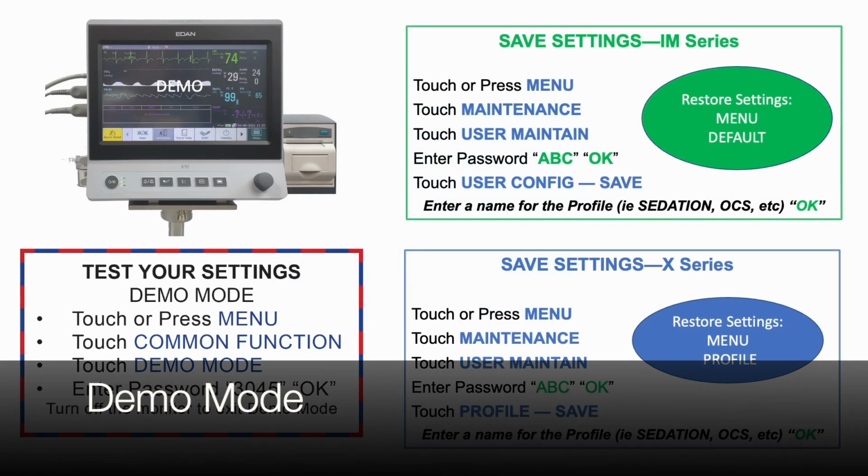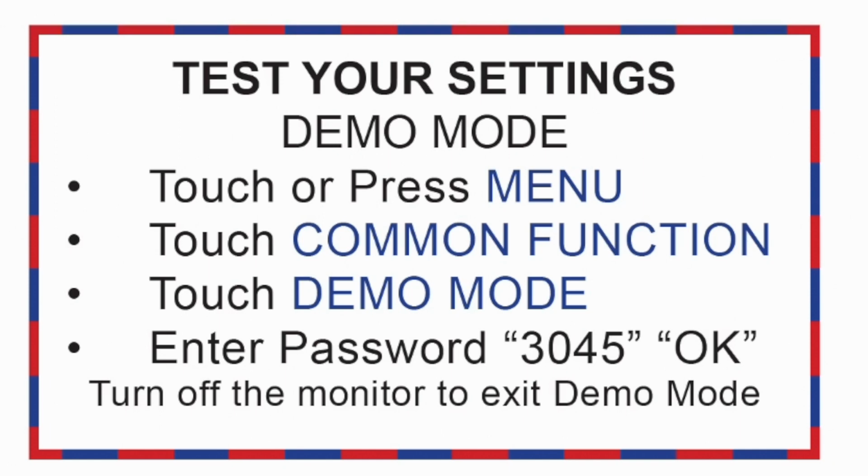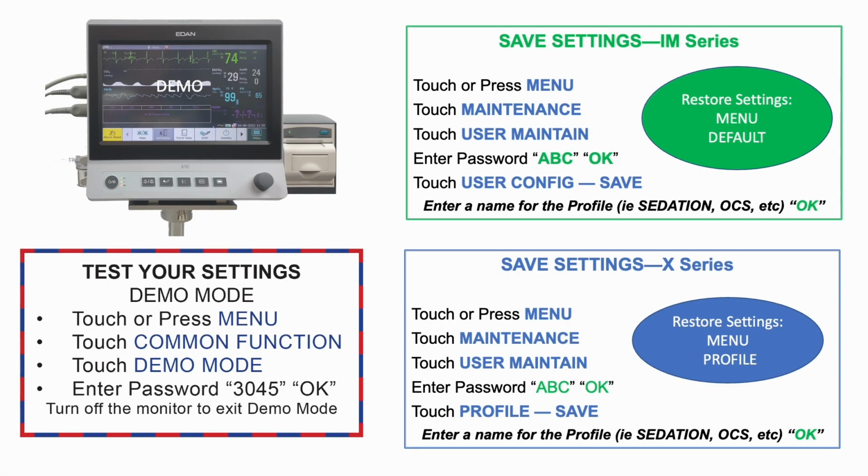Once the settings are complete, it's a good idea to test the settings by putting the monitor into demo mode. Touch or press Menu, touch Common Function, touch Demo Mode, enter password 3045, then touch OK. To exit demo, turn off the monitor or touch Menu, Common Function, Demo Mode.